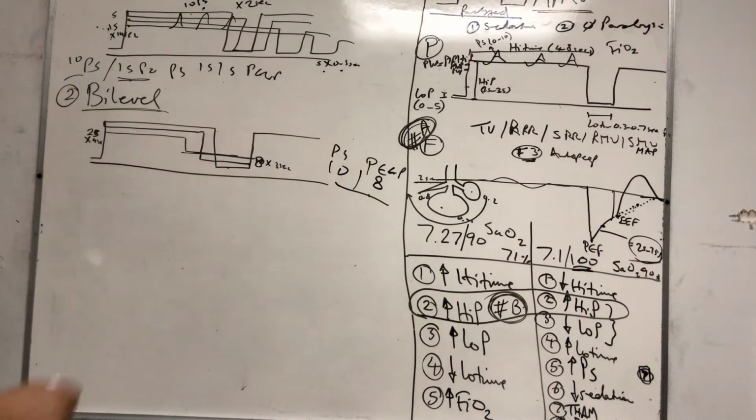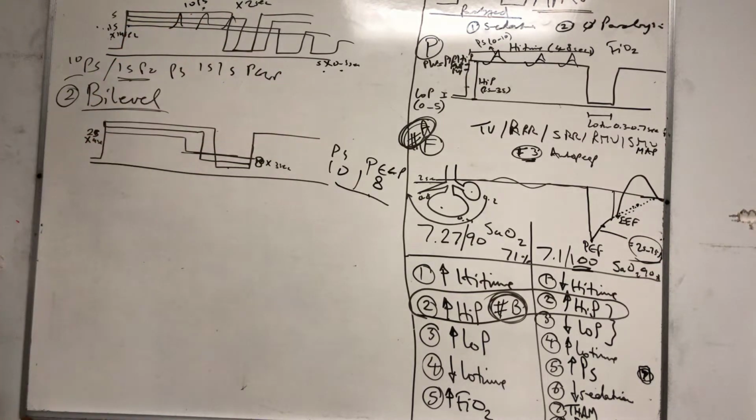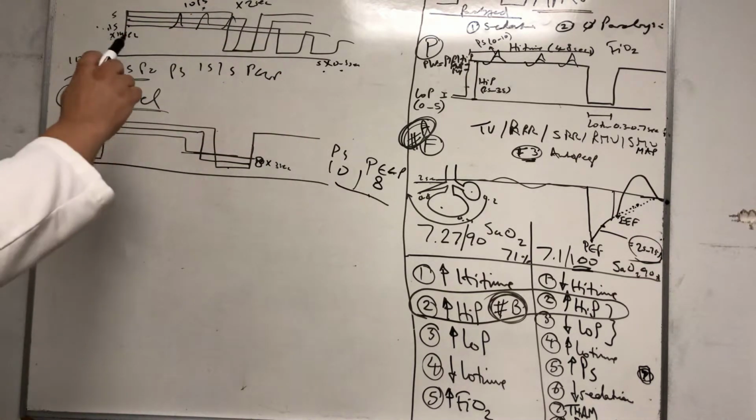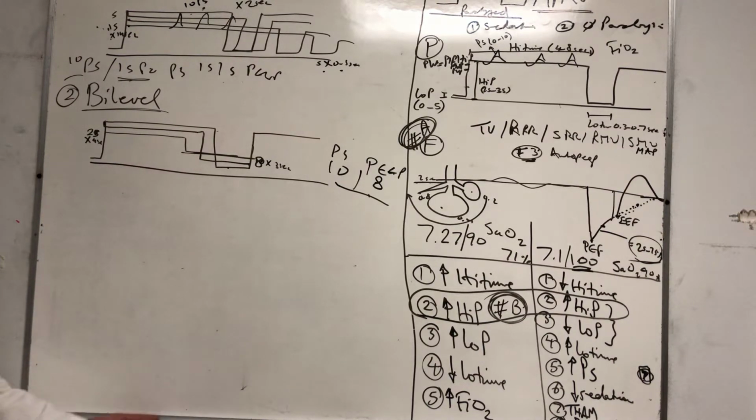The bi-level weaning is a faster way of weaning than the drop and drag, but it's used much less because most of the time when we put somebody on this, they're actually hypoxic and terrible. So that's why this is more suitable. This is like, you made a mistake basically. You put the patient on it and now you're saying, no, he's improving very quickly, I give him Lasix and everything. Right? So that's your bi-level.